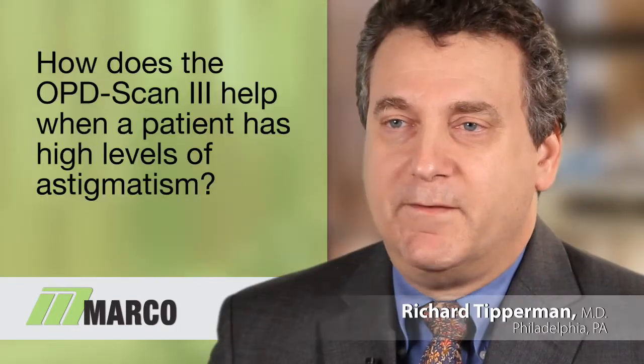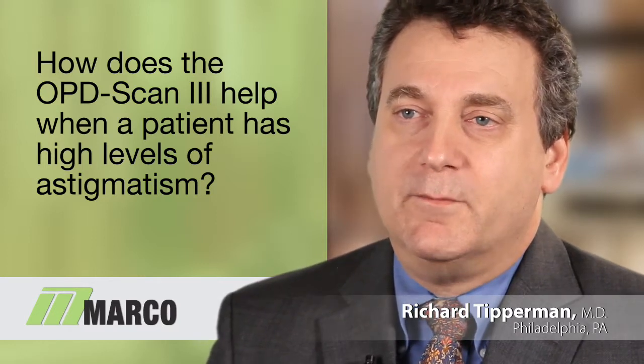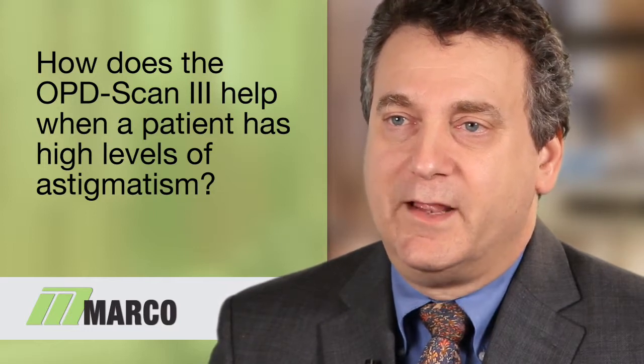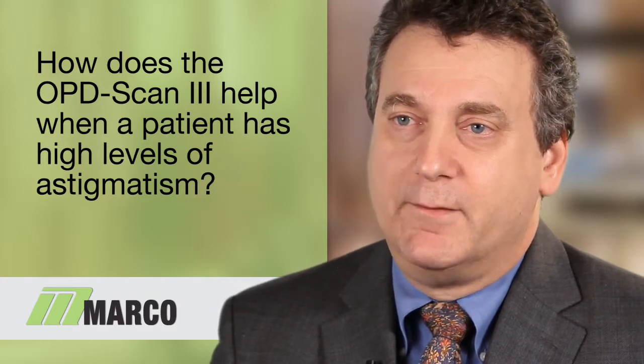The OPD scan can be very helpful when trying to make a decision as to what form of advanced technology lens is best for patients. Some surgeons are comfortable using multifocal lenses in patients with high levels of astigmatism, whereas others want to use toric lenses. And in many patients, they could potentially be a candidate for both.